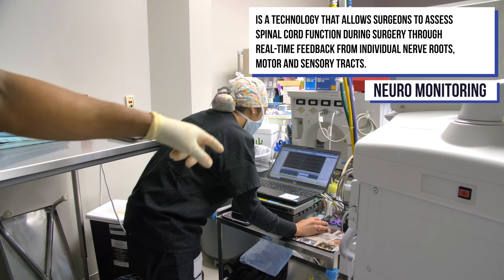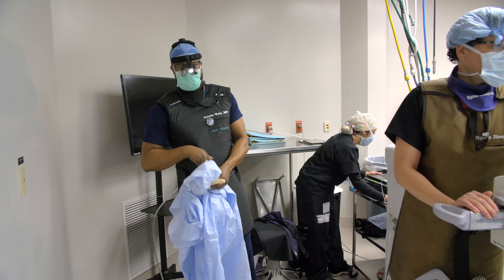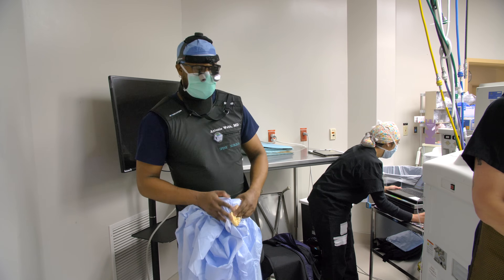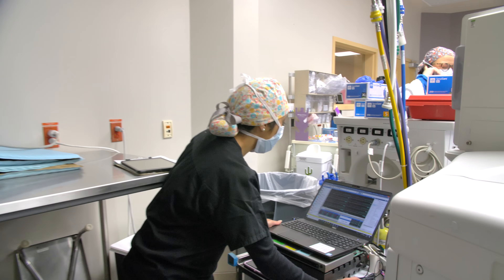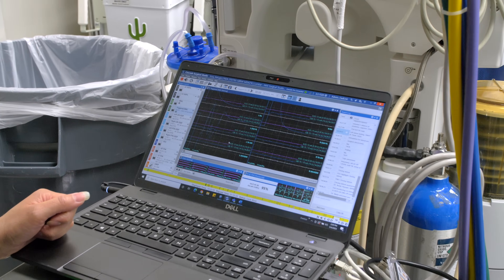A technician is monitoring all of the patient's nerves during surgery. This is standard practice for spine surgeons — there is a neurologist off-site and we're in constant communication throughout the operation. The patient is hooked up to wires monitoring EMG and SSEP, which covers the sensory and motor components of his neural elements.